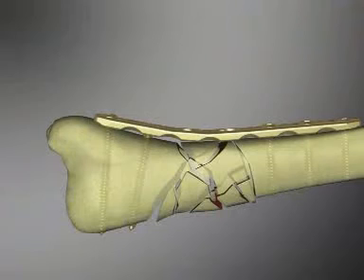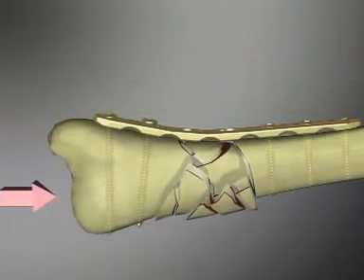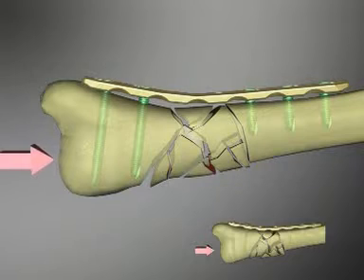If fractures close to a joint are stabilized with conventional non-locking screw and plate systems, there's a danger of a secondary loss of reduction due to successive loosening of individual screws in the section close to the joint. Anchored, stable angle screws cannot loosen under cyclic loading and so prevent this secondary loss of reduction.